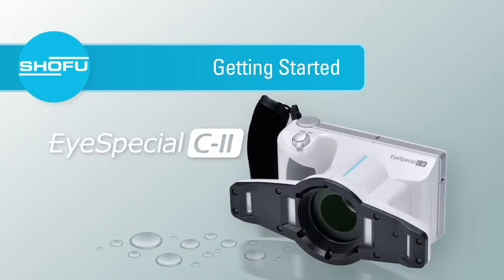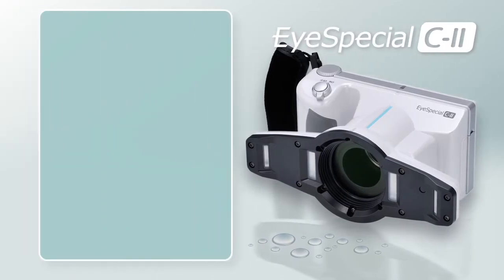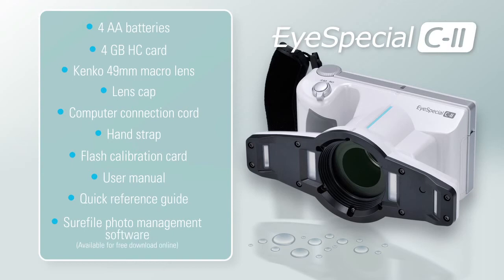Getting Started. Everything you need is included. The iSpecial C2 comes with four AA batteries, a four gigabyte SDHC card, a high performance Kenko 49 millimeter macro lens, a lens cap, a computer connection cord, a hand strap, a flash calibration card, the user manual, the quick reference guide, and SureFile photo management software available for free online download.